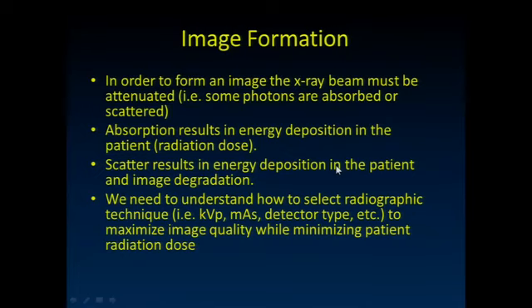If all of them made it through, the image would just be uniformly white, neither of which is helpful. We rely on the fact that there's differential absorption of those X-rays as they go through the patient. Okay? It would be great if when the X-rays interacted with the patient, they were just stopped and didn't continue on. Okay? And there's one effect that actually is going to do that for us, the photoelectric effect.